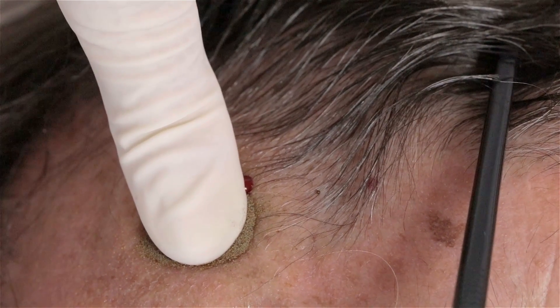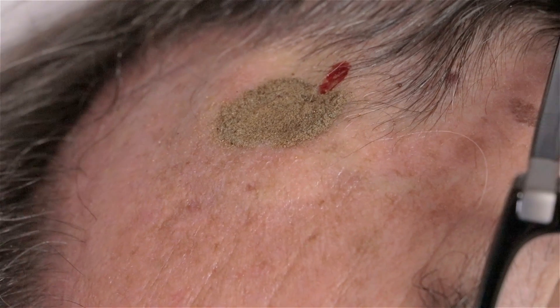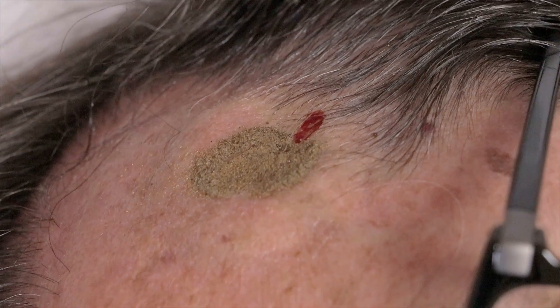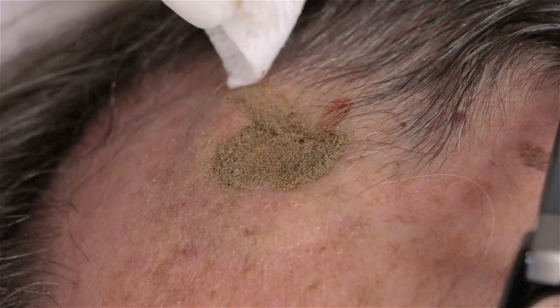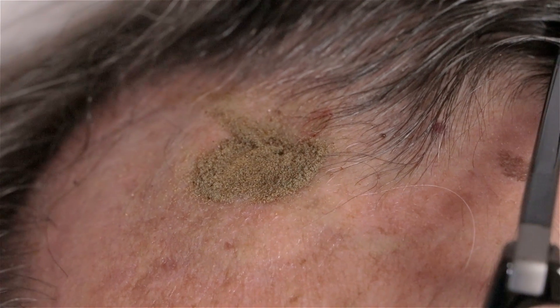Give me a minute. Okay, it's been 60 seconds. I'm going to take my finger off. And except for this tiny little bit of blood here, which was from the side, the wound itself is all sealed up.